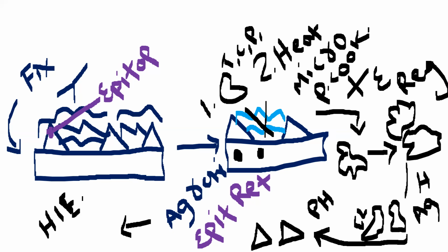So what does HIER stand for? HIER stands for heat induced epitope retrieval. I said, right, the part of the antigen that binds with the antibody is called the epitope. So in order to retrieve the epitope, since we are using microwaves or heat, this technique is called heat induced epitope retrieval. So these are the methods we are going to discuss in the next few minutes of this lecture.